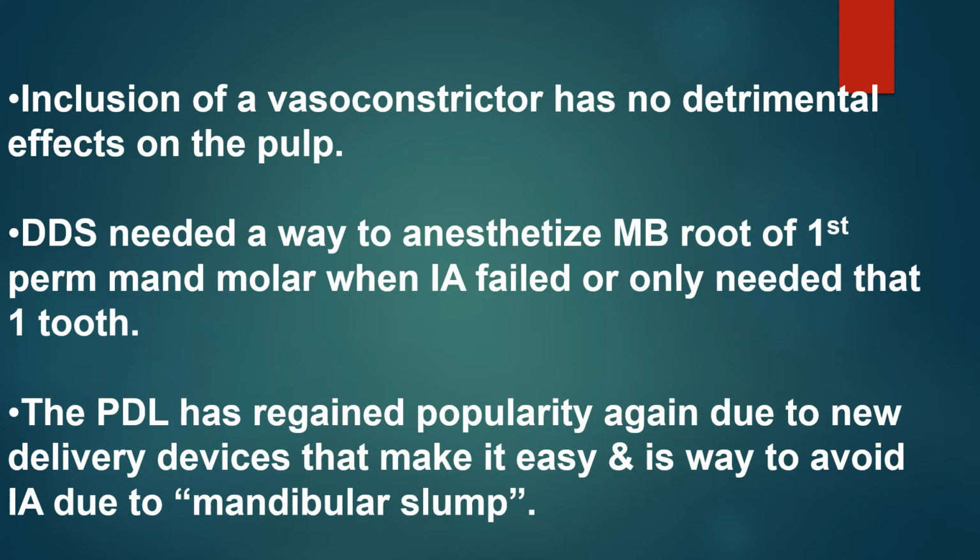So the PDL came out and was very popular. It's been out for decades and decades. Then all of a sudden it was not popular, and dentists did not want to use the PDL anymore at all. Now it has regained popularity because of all the new delivery devices. Prior to this, they had to give it with a regular syringe, which you can still do, but there were needles that broke off. You're putting a lot of pressure on with a normal syringe, and they had enough mistakes that it lost its popularity.